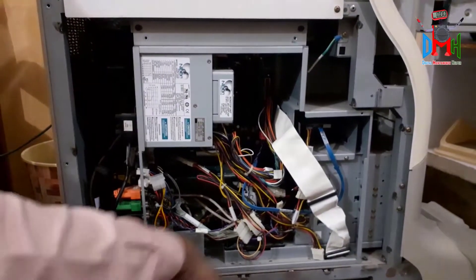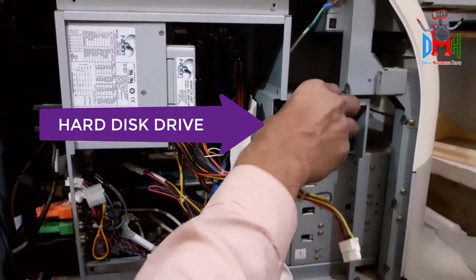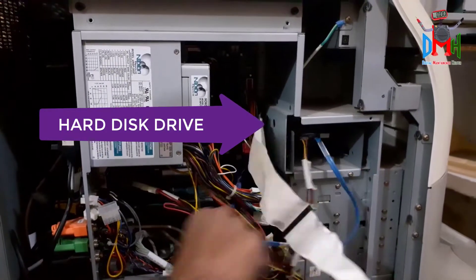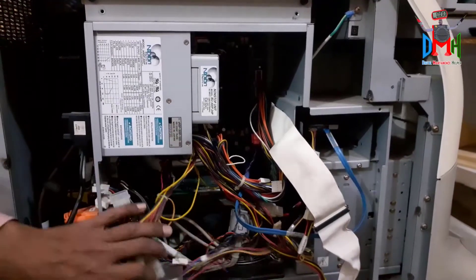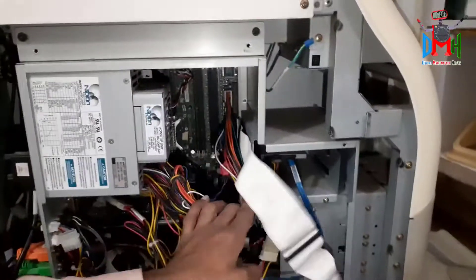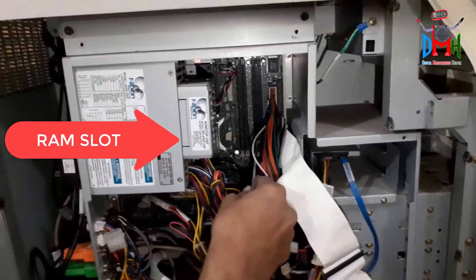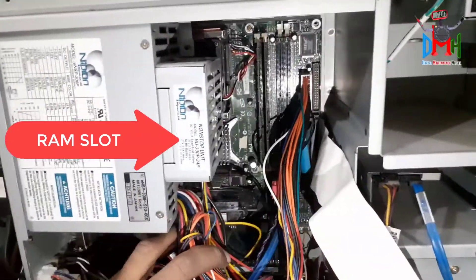Here is its hard disk — it may be SATA or IDE. You can change it or replace its software. Here is the RAM slot; you can change it for a bigger one.